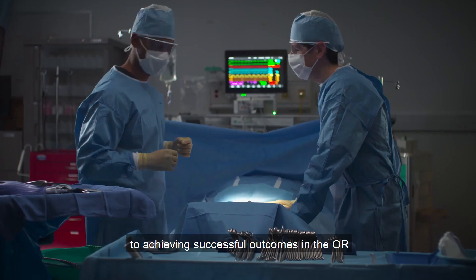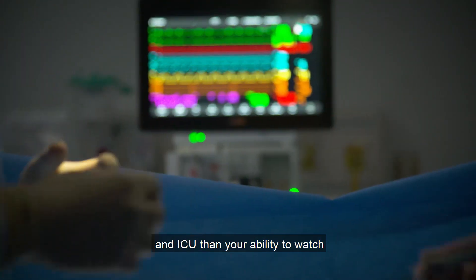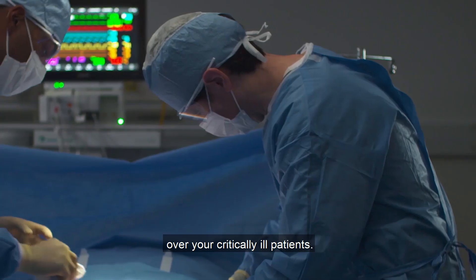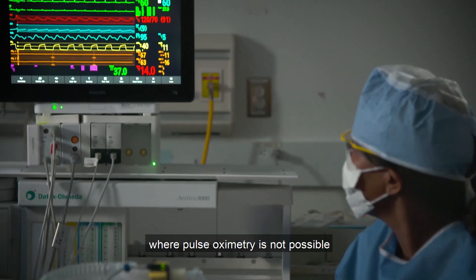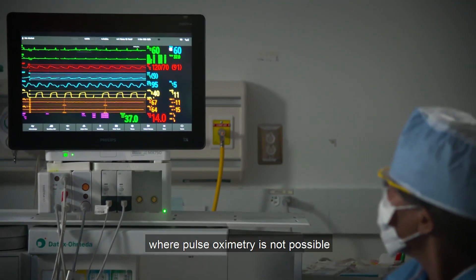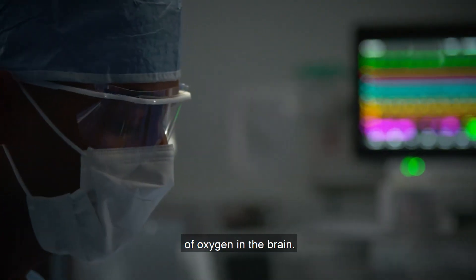Nothing is more important to achieving successful outcomes in the OR and ICU than your ability to watch over your critically ill patients. Especially in clinical situations where pulse oximetry is not possible, or simply not enough to be fully indicative of oxygen in the brain.